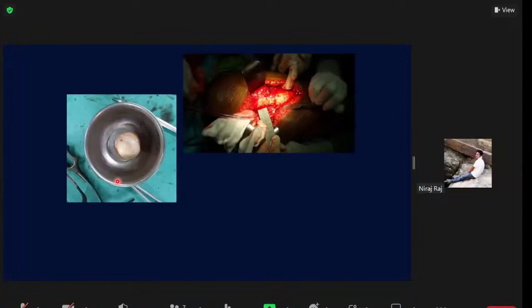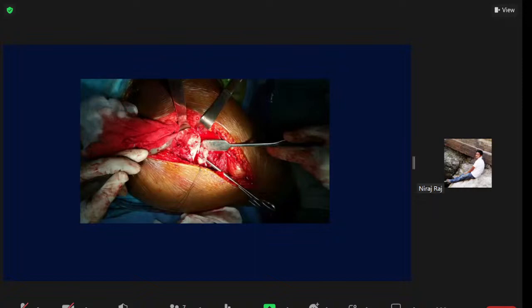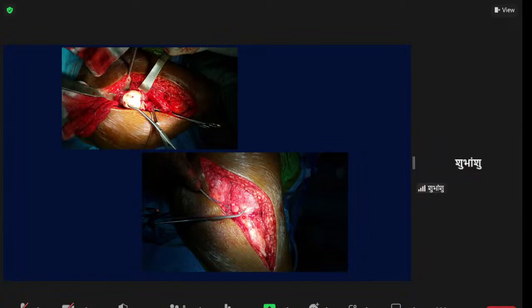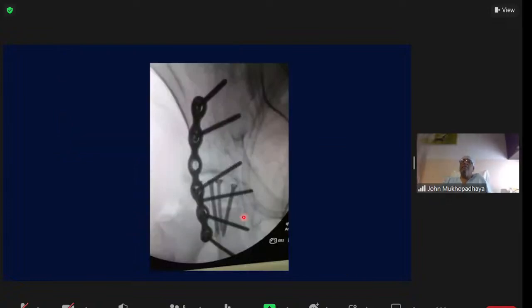Then we did the trochanteric flip osteotomy. Then you take the safe surgical dislocation, and there's the neck and the missing fragment in the head here. See that? So there we put the head back, fix it with screws, then reduce the head, and then you put in just 2 screws to fix the trochanteric osteotomy. Because this is a flip, it will fall back and stay. You don't need very robust fixation of that trochanter. Okay, and then obviously the acetabulum has been fixed.